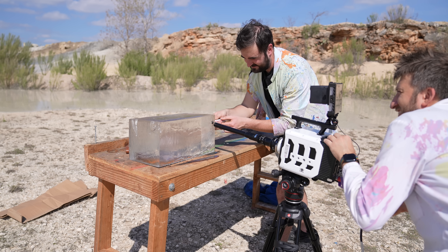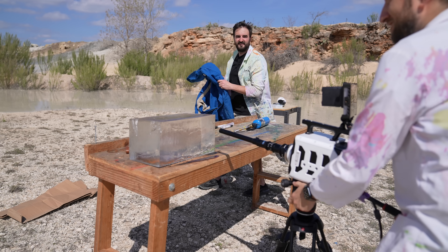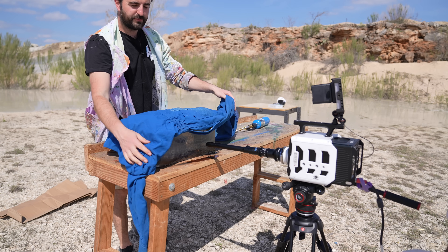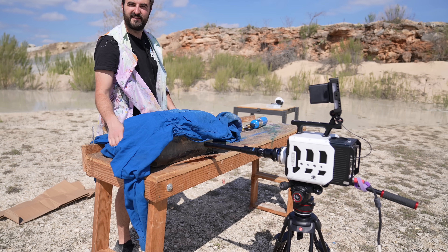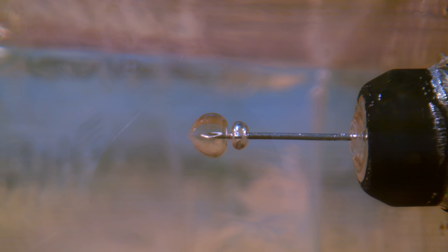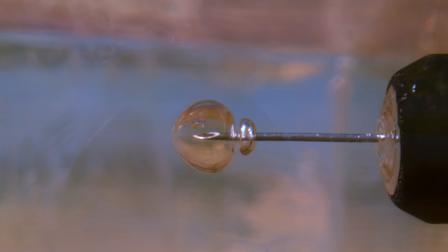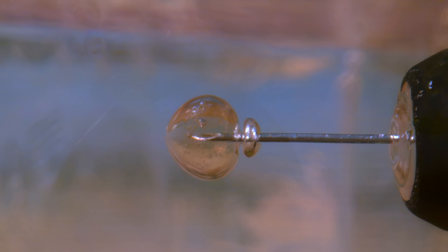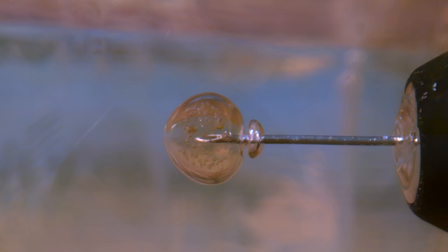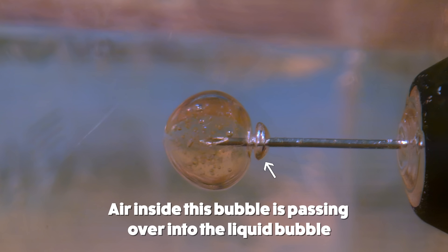It looks gruesome. I don't know if I like that. It looks like all that insect footage of like a wasp injecting an ant or something — like a proboscis going into something. It's very Starship Troopers. You can see the liquid shooting out, you can see it like bubbling. It's wounded the gel — look where it's gone in and then you can see the opening hole. Luckily the pen was tilted so you can see the physical liquid coming out. That was pure luck, but there's some air in there. The needle's up so you can see the channel that the liquid's coming through. I think the air has been brought in with the needle, and that's where it's like that bit in the gel.